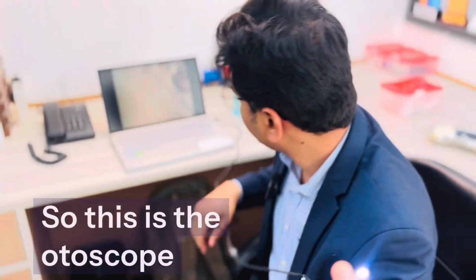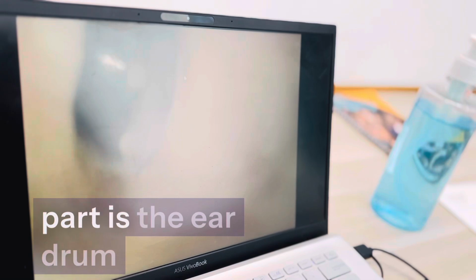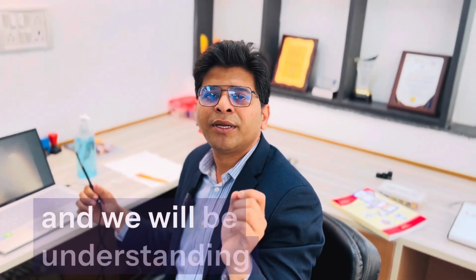So this is the otoscope, and you can see on the screen, यहाँ पे आप देखिए, the shiny part is the eardrum. This is a clear ear canal, and this is how we are going to conduct the examination, and we'll be understanding about the status of the outer ear.